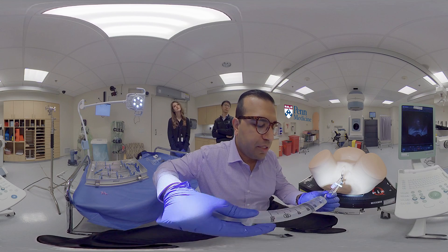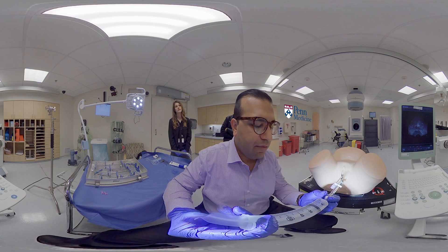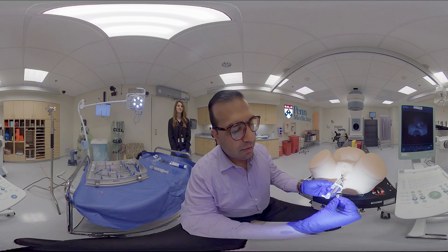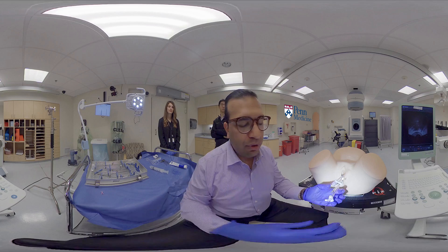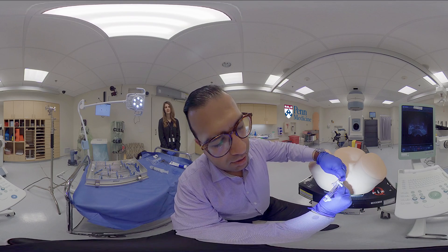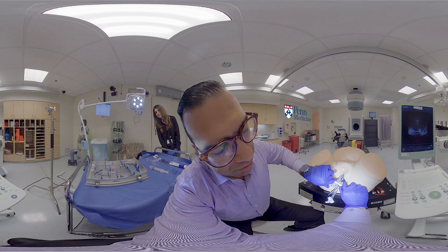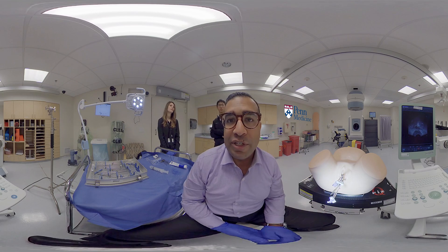We complete the procedure by filling the posterior balloon to the desired filling level. Following this, we attach the balloons to the ring applicator and ensure everything is in the correct position. We verify that the applicator is built correctly, that it is rigid and does not move. And this would be the completion of the procedure.